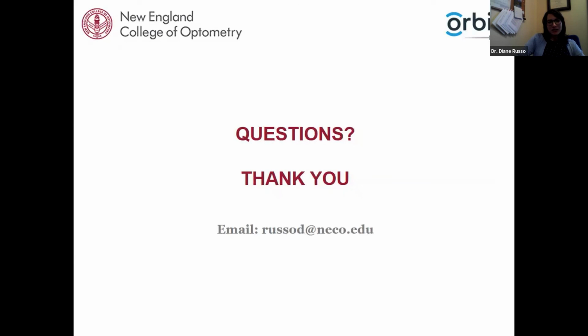The next question: how do you modify the retinoscopy results for children when they fixate on the light instead of a distance target, or do you not modify the ret results? You do. I have not done this procedure in a while. I don't see as many children anymore. You modify your test distance, and then because of that, you modify the subsequent net retinoscopy results, but I would have to get back to you on the specific modification because I have not done that procedure in a while.